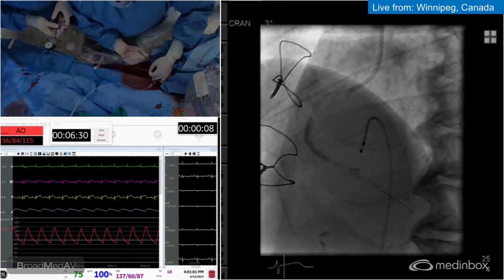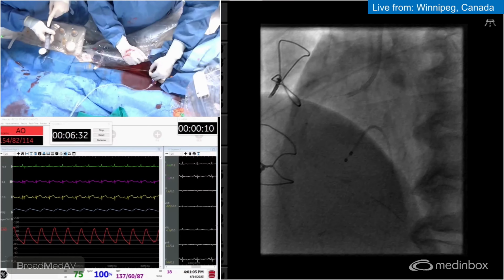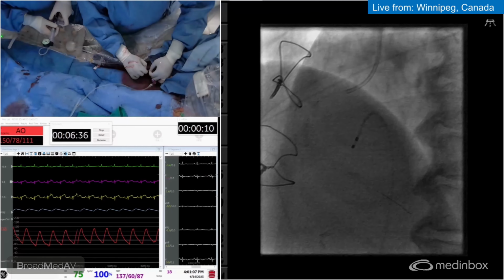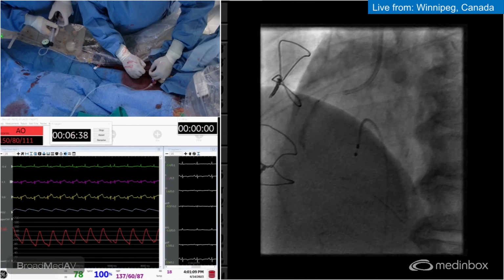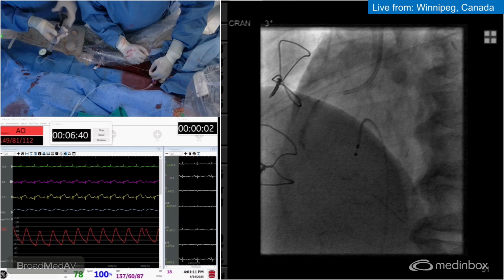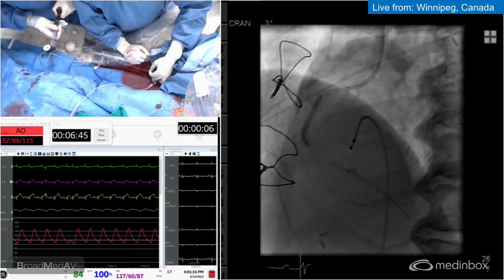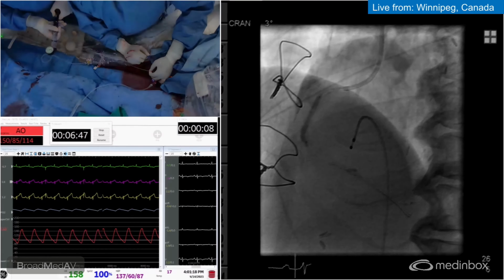That's pretty impressive. Even after multiple runs, I think we needed the atherectomy to be able to deliver. Yeah, this was an uncrossable lesion, right? So that's up to 20 there. I don't want to rupture it again. I think it's expanding. Good. That's the best we're going to get.